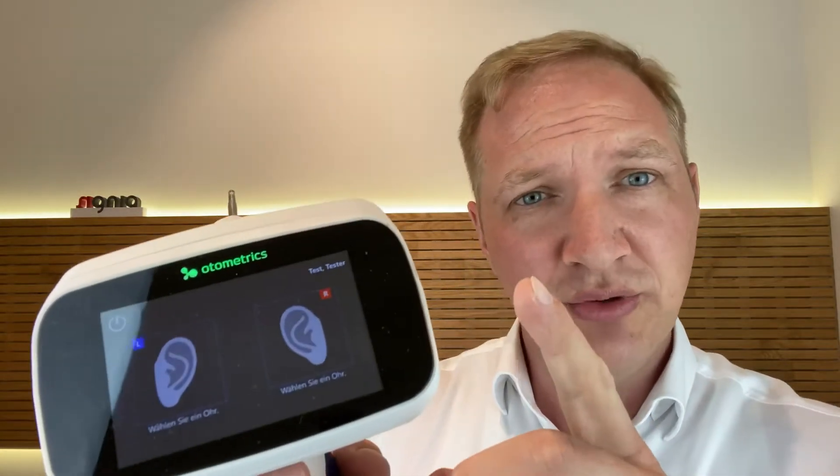In the past, we had to squeeze some silicon material into the ear of our patients to get a proper ear impression. These times are over. Today I'm going to show you how we work with the Otoscan from Otomatrix to 3D scan your ears or the ears of your patients. This is a way that is way more precise and you cannot hurt your patient's ears, even if they had an operation or some kind of illness.